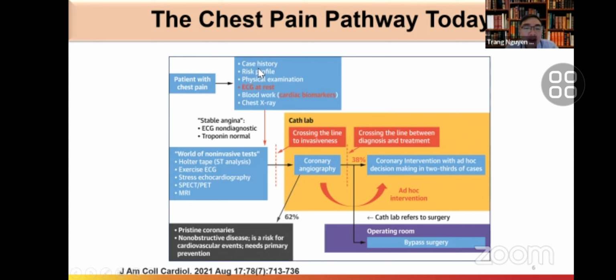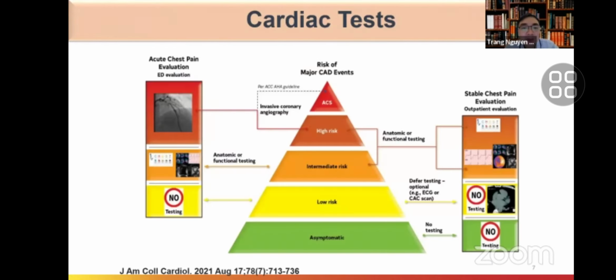First of all, we check the clinical history and some simple tests like ECG or chest X-ray, but we need a test that can provide very important information about the coronary anatomy and characterize the coronary arteries. For cardiac tests, we have many, like ECG, echocardiography, CTA, MRI, or angiography.